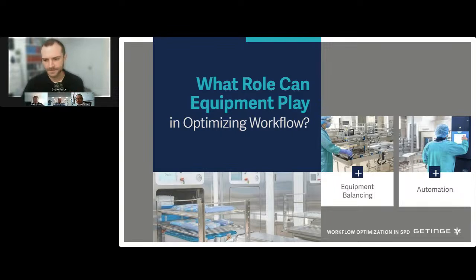Sure, Bobby. So I think a couple things. One, it's great to have all the vendor partnership and other elements come into play. But we talked about process workflows, et cetera. But I think one basic thing that folks have to keep in mind when it comes down to selecting equipment is what items you are putting through your washers.